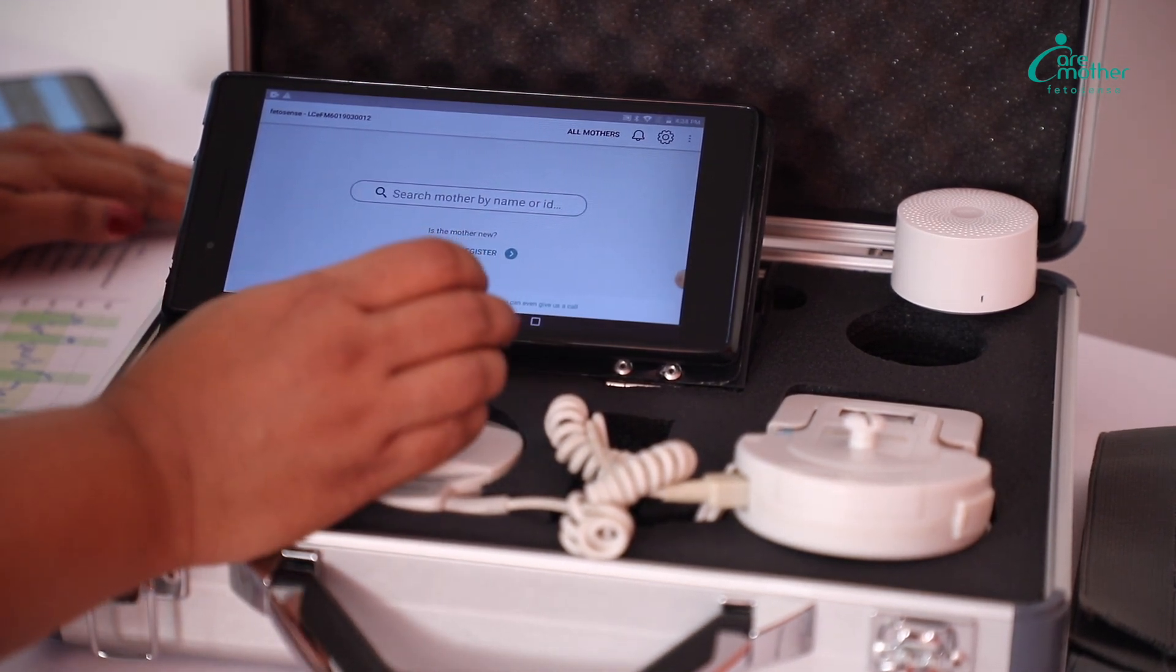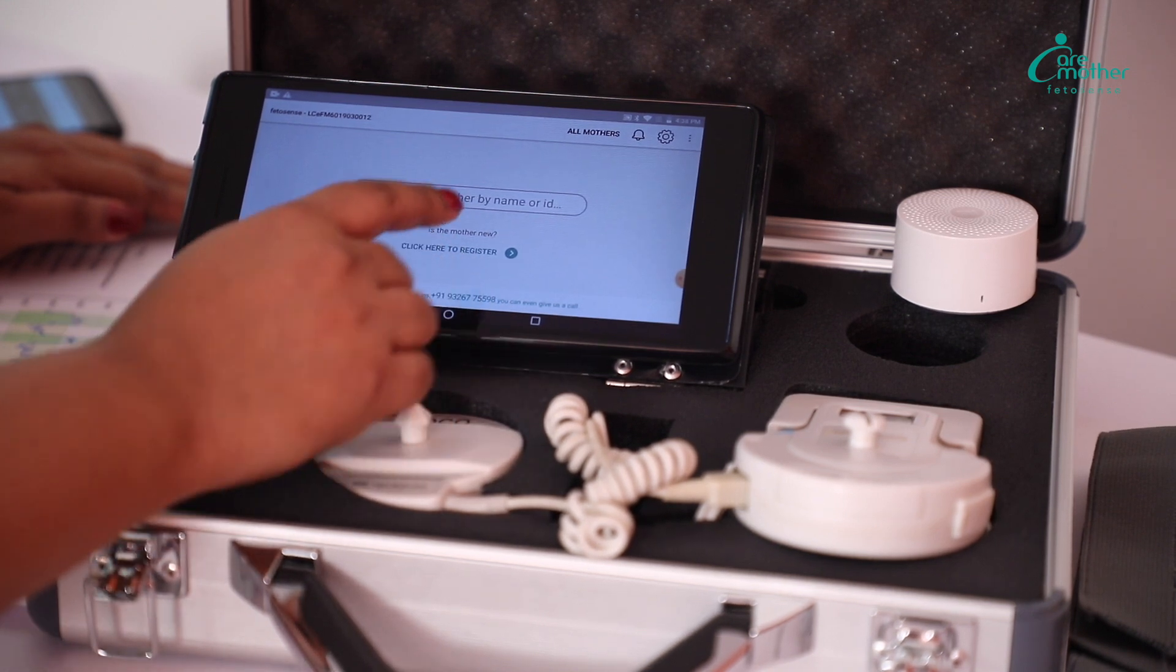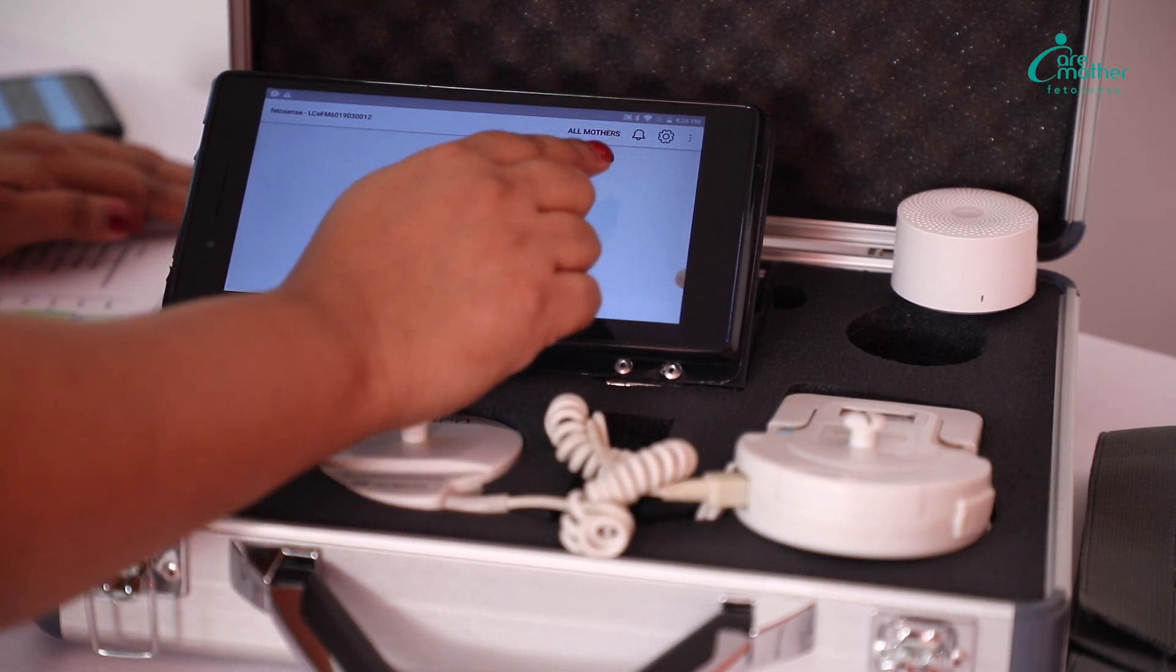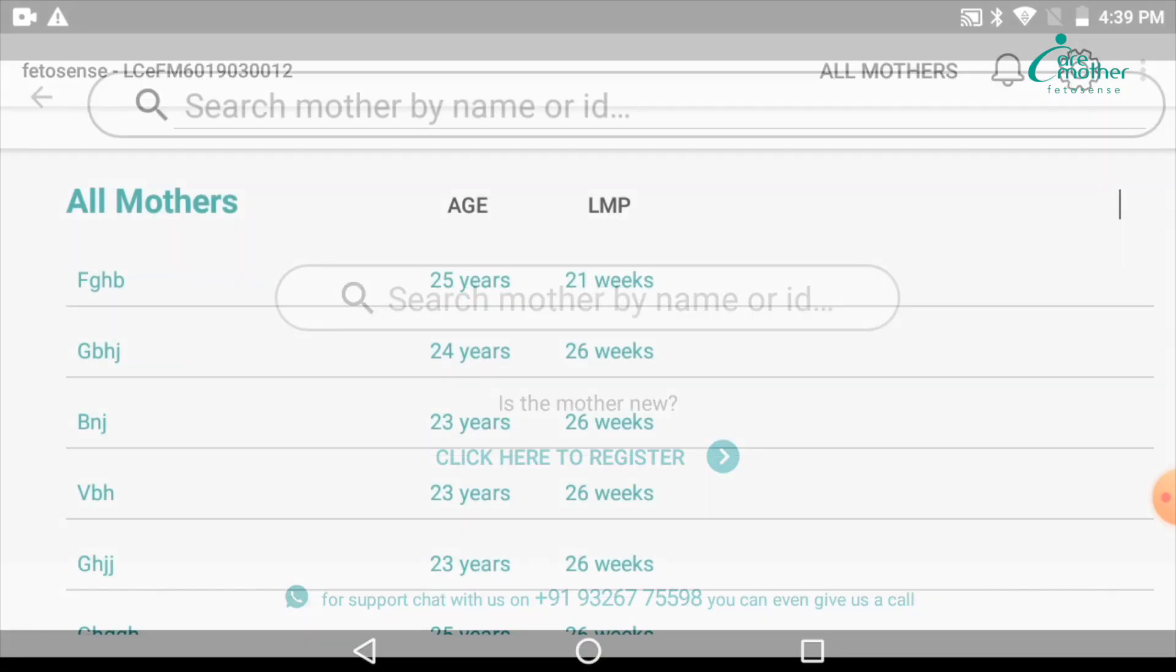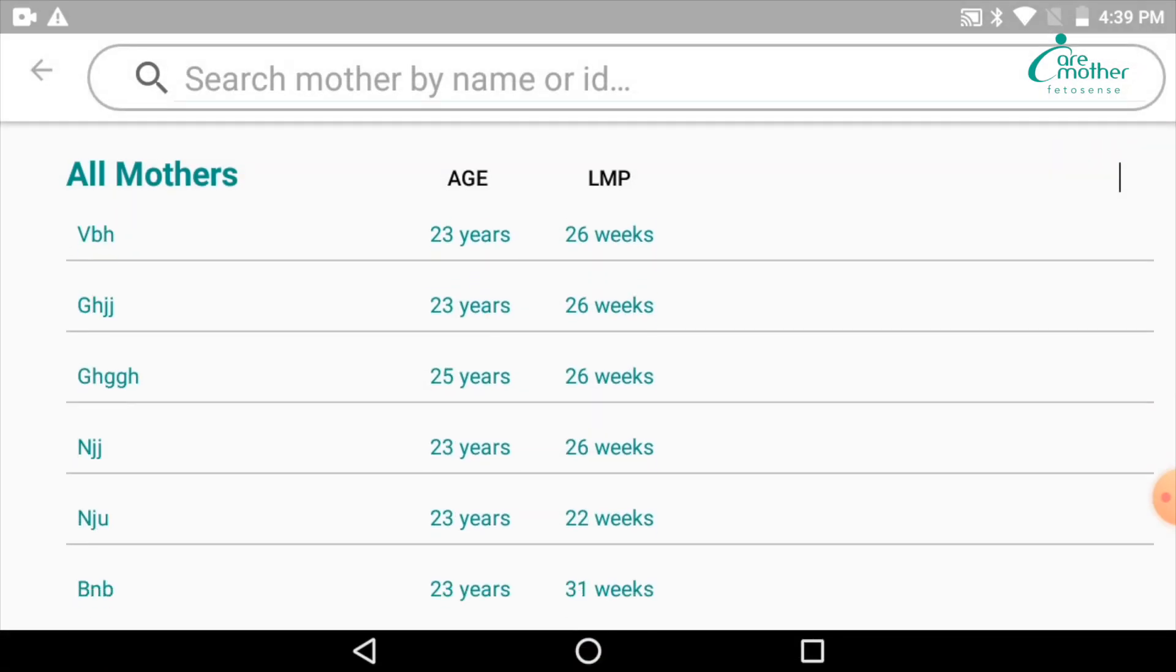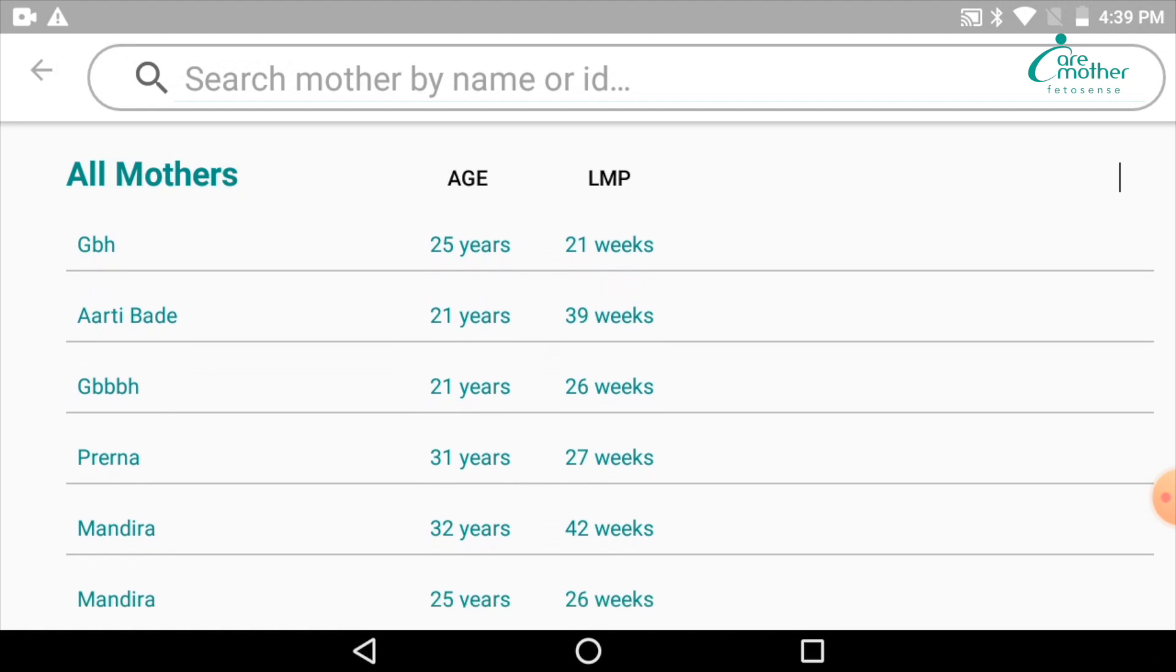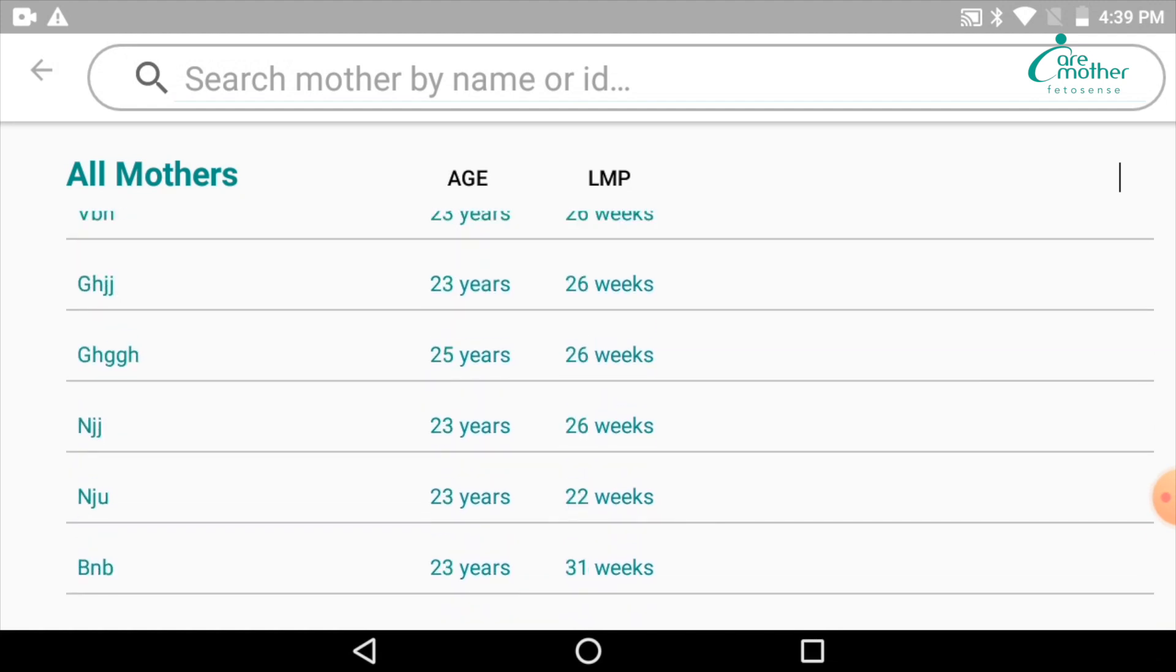Whenever you want to see previous data, you have to come to the main page. There is a tab on the right-hand top corner called All Mothers. You will have to click on that and you will be able to see all the tests that you have done so far on this device in the form of the patient profile.